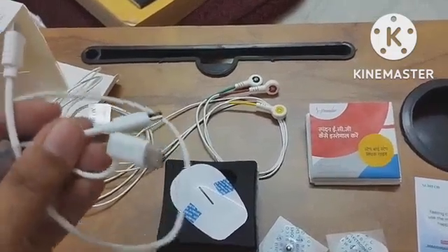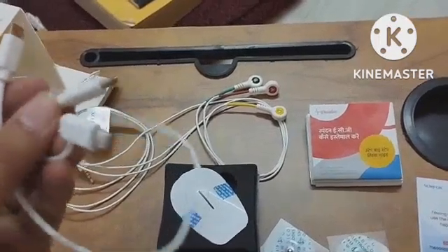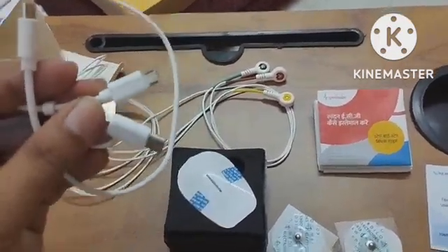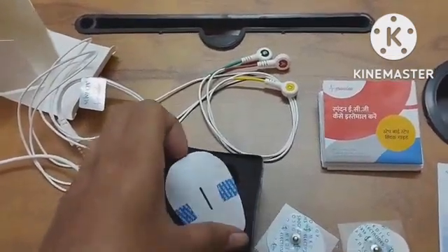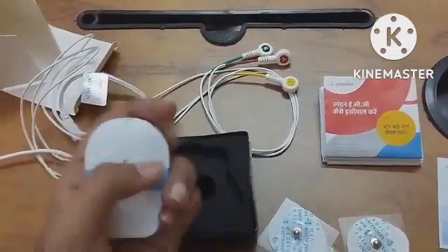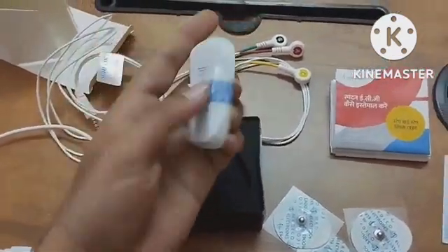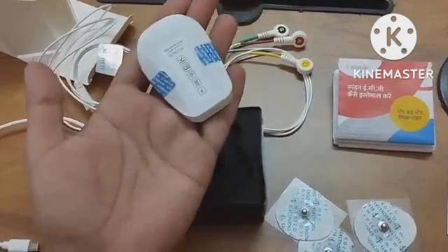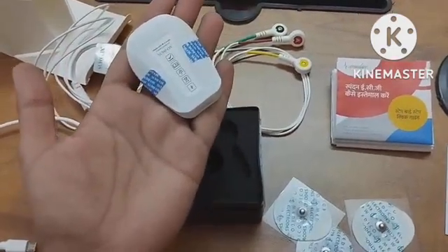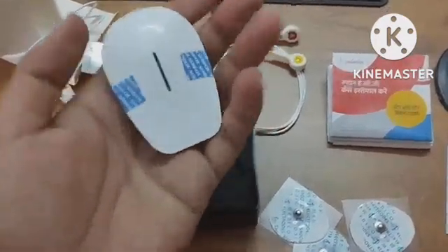You can use either a Type-C or micro USB connection. This is the Spandan small ECG machine. You can see how small it is — you can even place two machines in your hand at the same time, and it is very light.